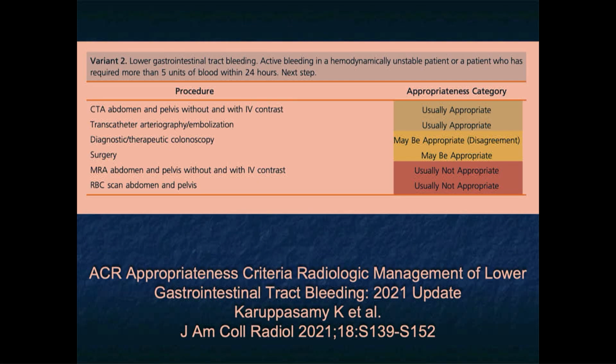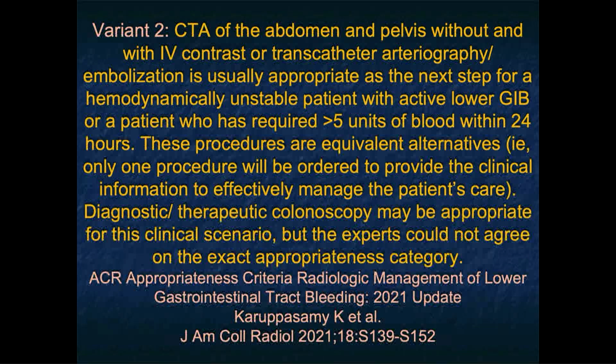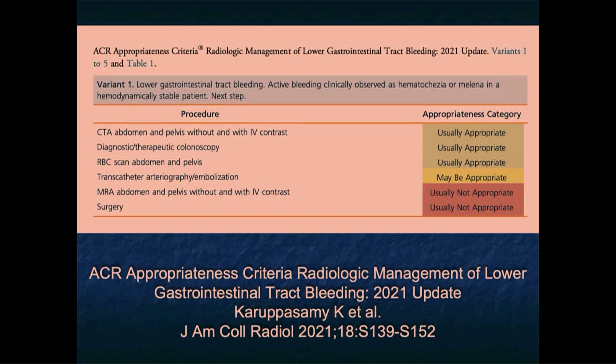If you look at ACR criteria, again, CTA is at the top of the list, but being appropriate from a range of variants. And I won't go through that in detail, but it pays to look at that because CTA, in fact, is put above endoscopy or any other imaging modality.